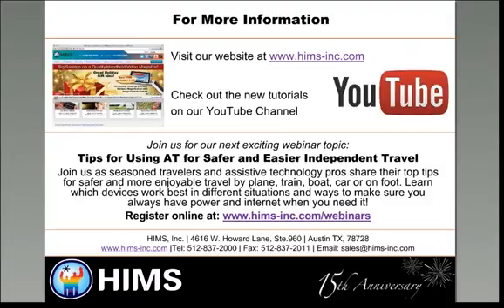Helen is asking, is what you compared with the BookSense also the same with the Victor Stream? So yes, the BookSense and the Victor Stream are similar devices to the Blaze EZ. And then Sherry asked, how portable is the eBot monitor? She says not the monitor, but the footprint of the eBot. It is very portable. I kind of compare it to a small shirt box.